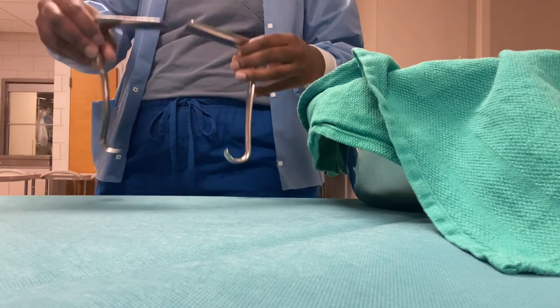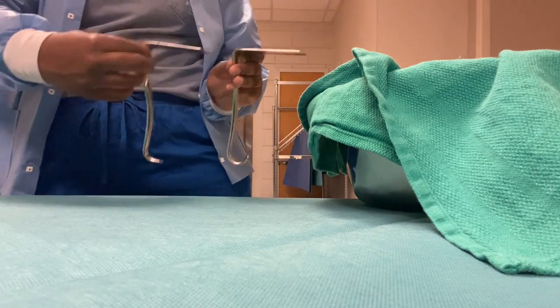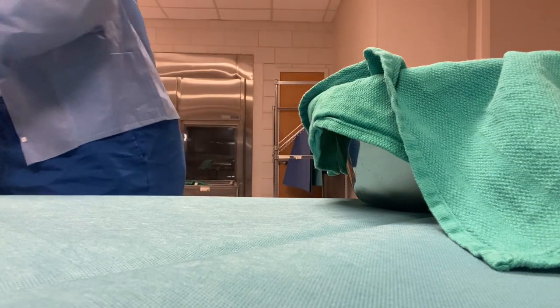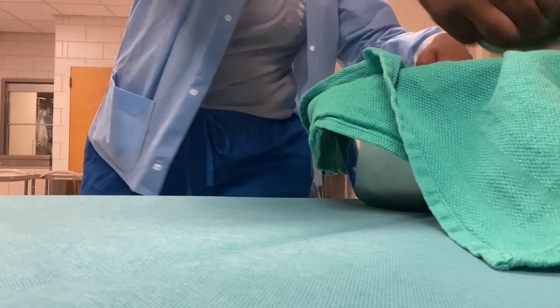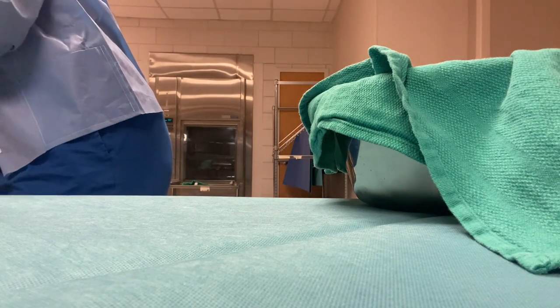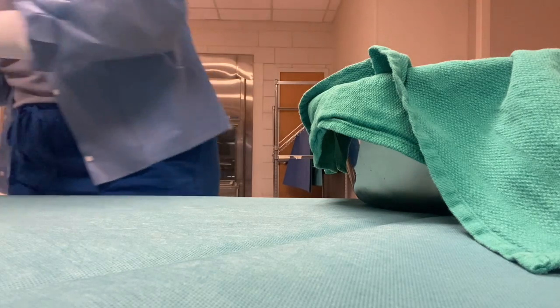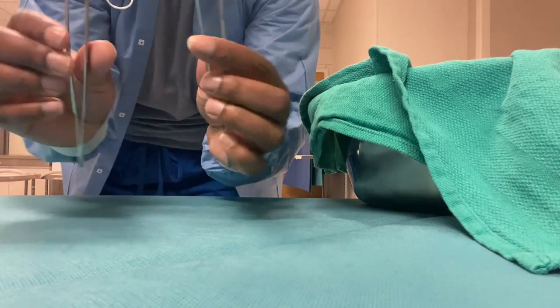Right angle retractors, two of them. Two small bowls. My pickups, one with teeth, one without.